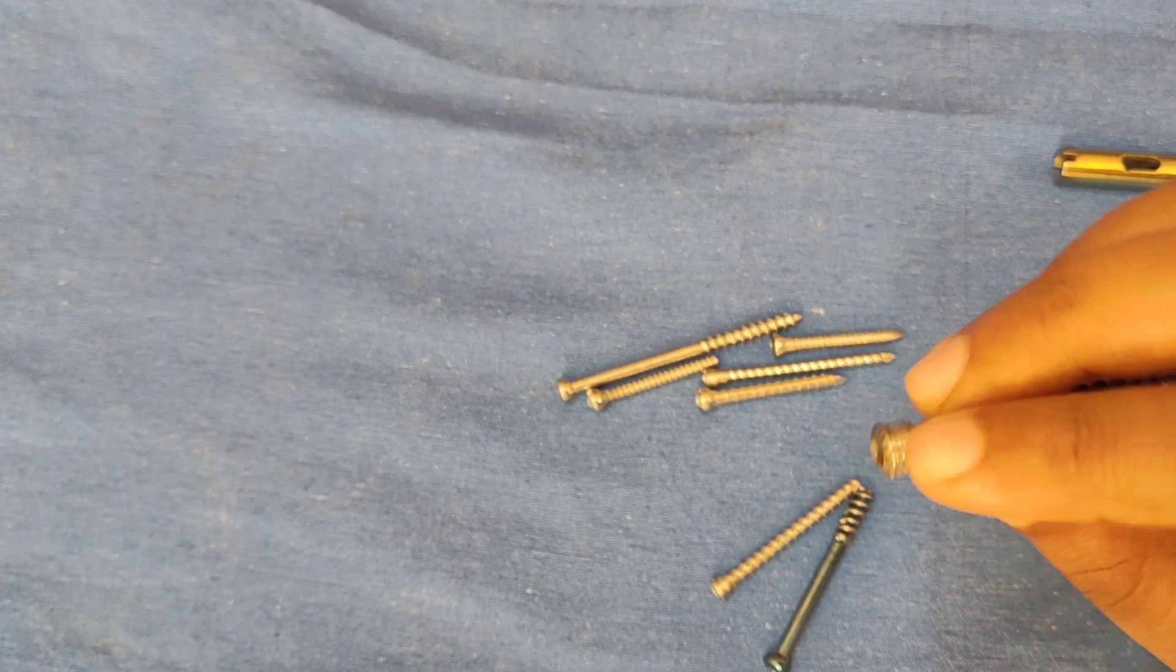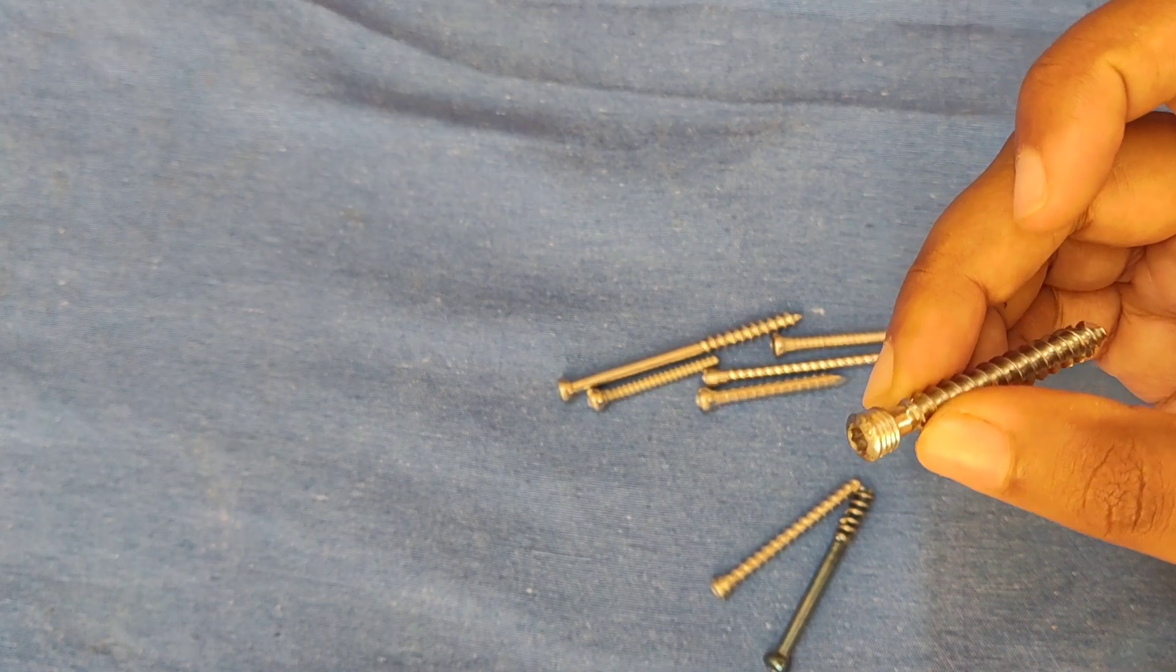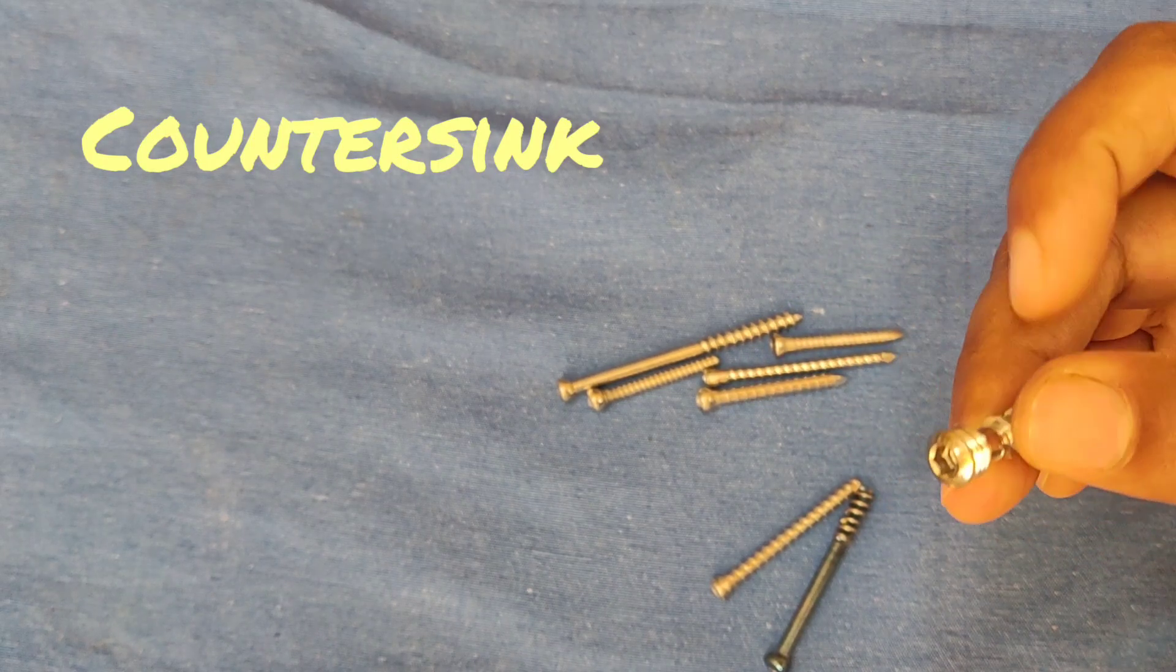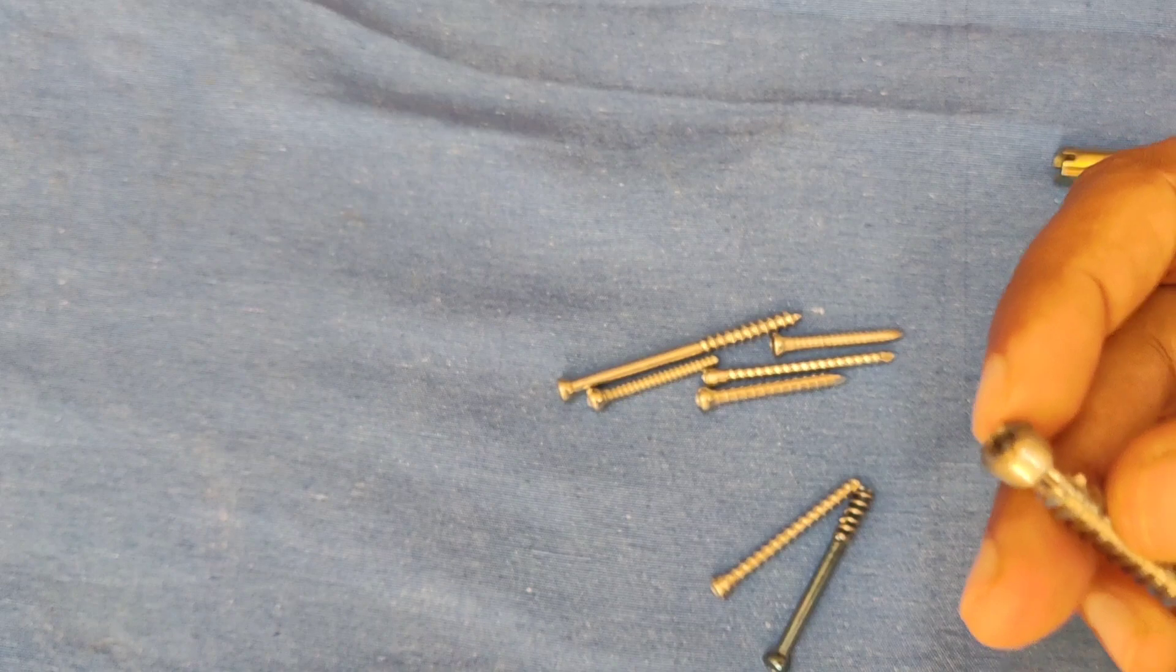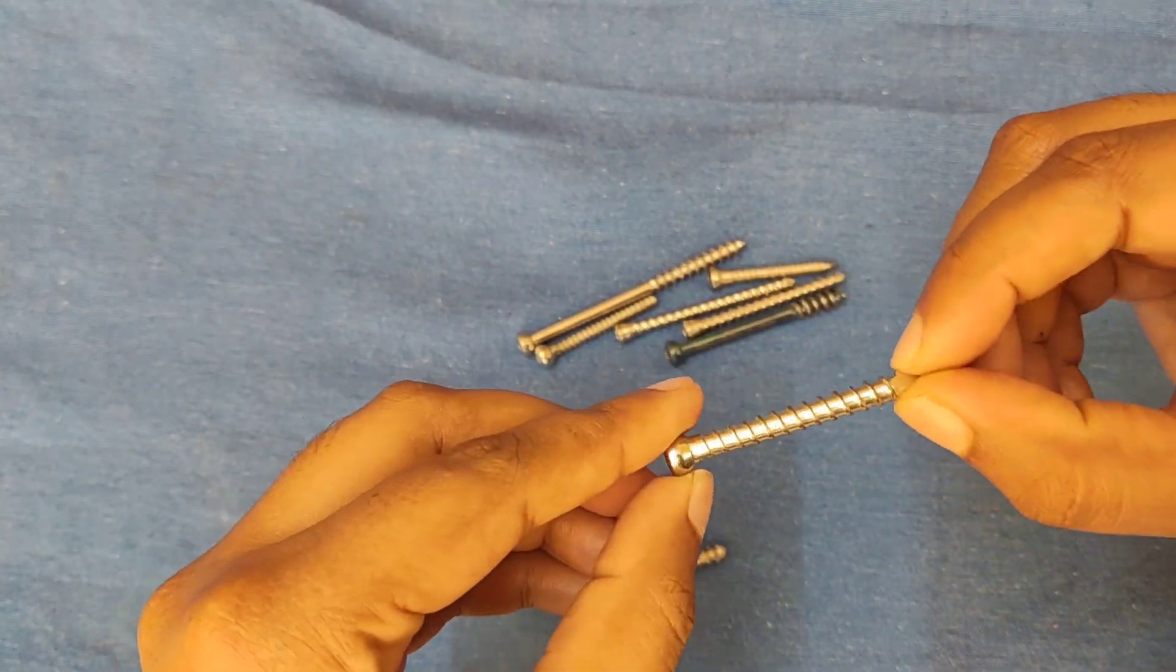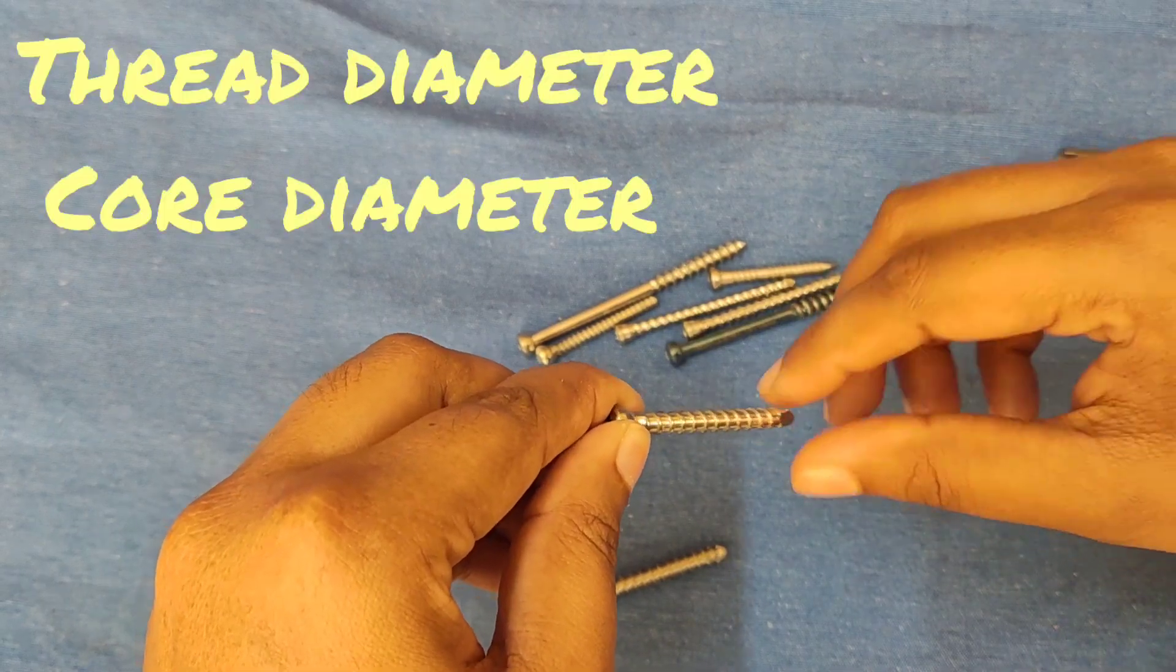Head has a recess for attachment to screwdriver. There is also a countersink for buttress which prevents hinging of head into bone. Shaft links between head and thread. Thread makes purchase of screw with the bone.